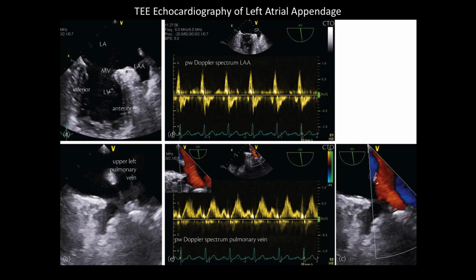And so this is why you go to the trouble of sticking a transducer down the person's throat: you can get a good view. Not always, but most of the time you get a pretty good view.